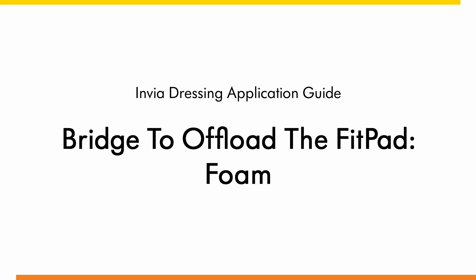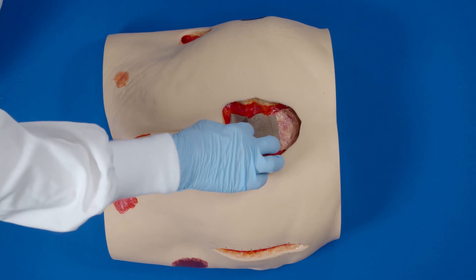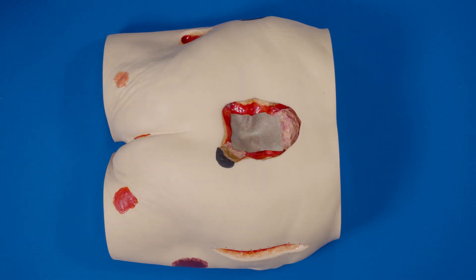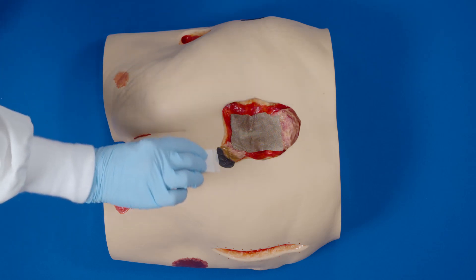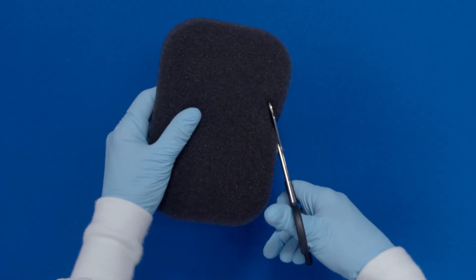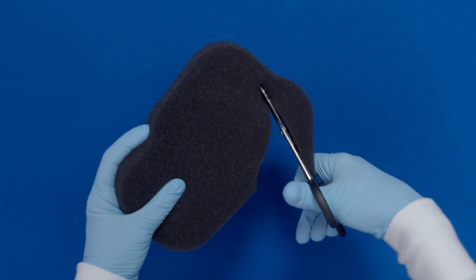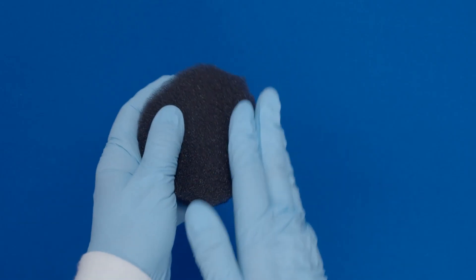Dressing application guide for bridging to offload. Fit the pad foam: thoroughly clean the wound. If required, apply a non-adherent contact layer over bone, tendon, or other sensitive structures. Apply skin prep to protect the peri-wound skin. Cut the foam to fit the size and shape of the wound. Do not cut directly over the wound.